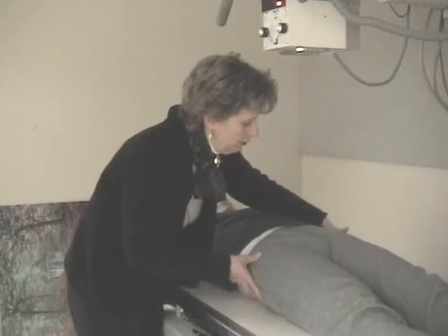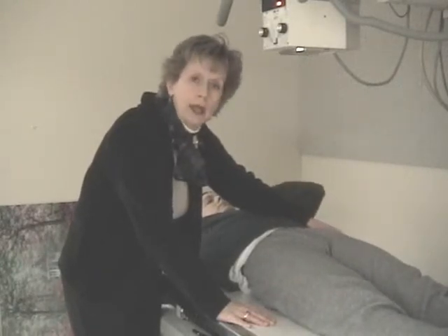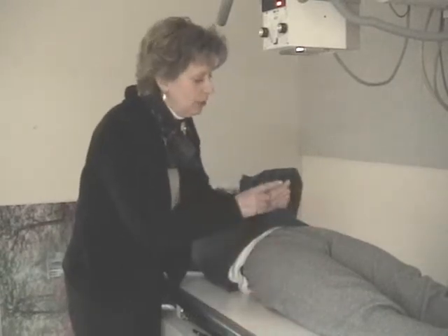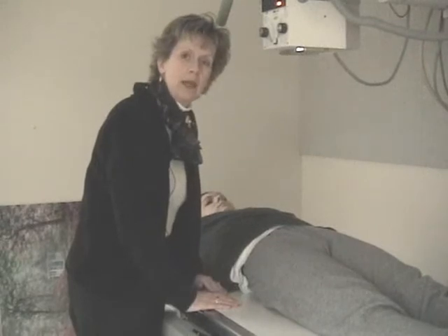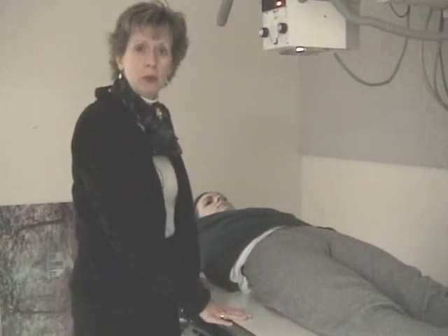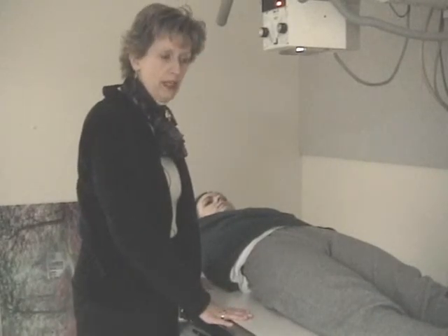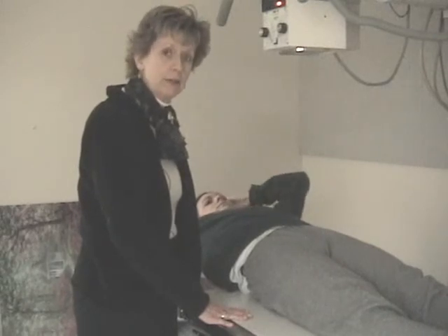Make sure that patient's pelvis is flat. When you invert the feet, your evidence will be that the lesser trochanter will be barely visible. No more than, say, an average tip of a thumbnail with some white on it. Barely visible. That will indicate that you've done a good job with the pelvis in an AP position. Patient should be straight. They're in a gown. They should not have underwear on. Rotate the feet inward whenever possible, but if that foot is flat, do not attempt to rotate that. It is more than likely fractured. That's your AP pelvis. Okay?